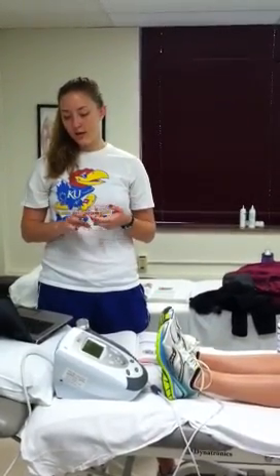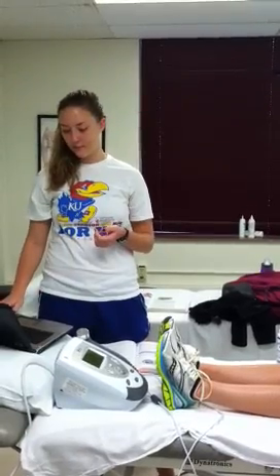Some of the contraindications would be pregnancy. You don't want to use it over the heart or the eyes, or if the patient has a DVT or any malignancies. Precautions would be acute infections, bony prominences, growth plates, and desensitized areas.